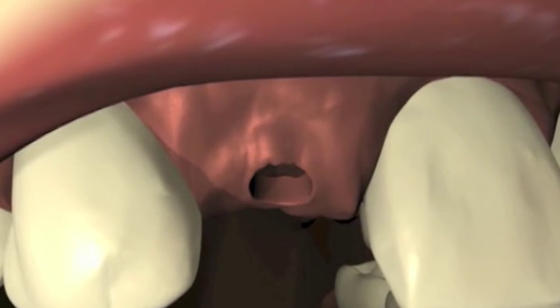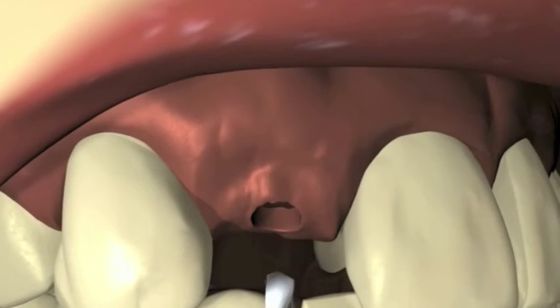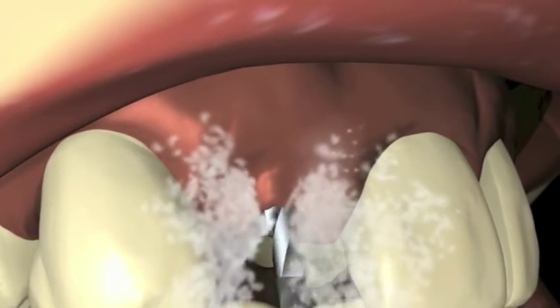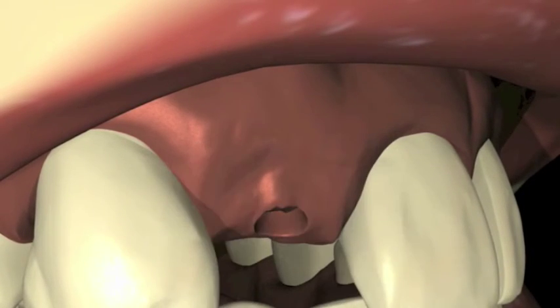a full-thickness mucoperiosteal flap should be reflected. The 1.5 mm diameter twist drill at 1,000 to 2,000 rpm creates a precise initial site for the implant. An external flow of sterile irrigation should be maintained.